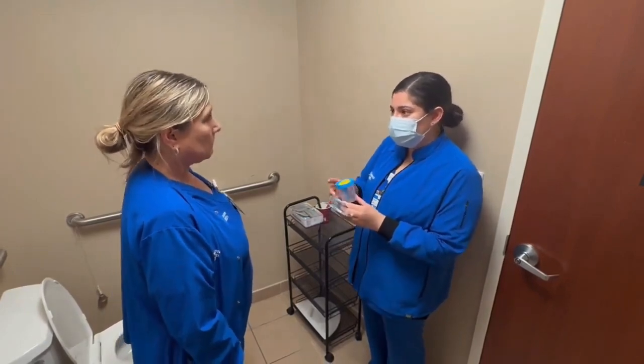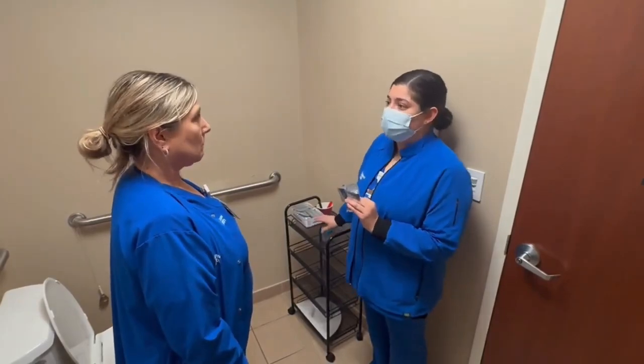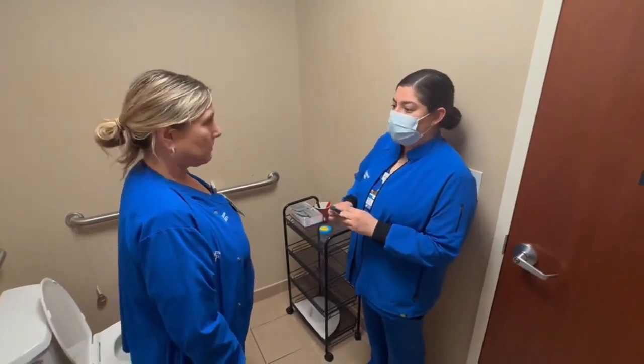Once you're finished, you can carefully place the lid on your sample and set it down on the counter. Do you have any questions? No. Okay, thank you.